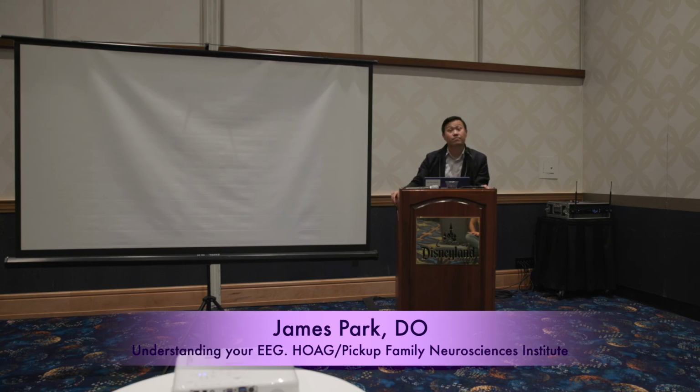You would suspect that EEG would pick those up? You may not. I would say a majority of the time you're not going to see much on the EEG. How would you catch that? Would you have to do a grid, or how would you plan for an SEEG to find the location? It depends on the symptoms and what your hypothesis is. So the epileptologist will have to decide that.